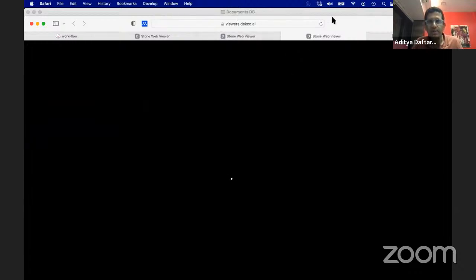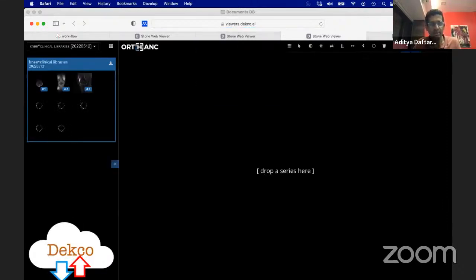Let's see if we can get something more on this case. It's not loading. Here we go.